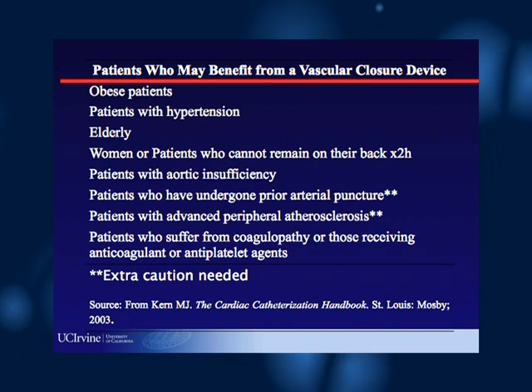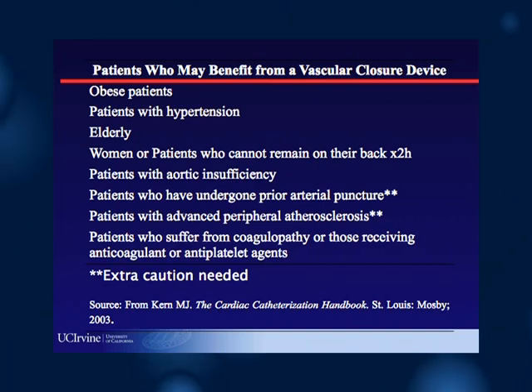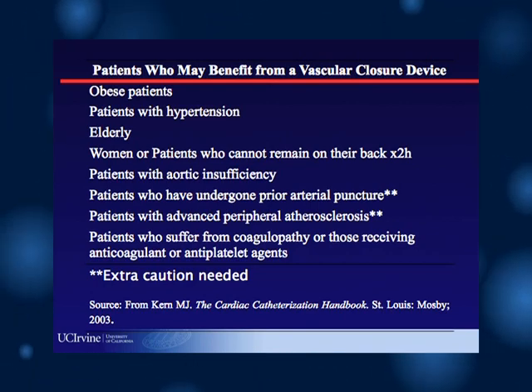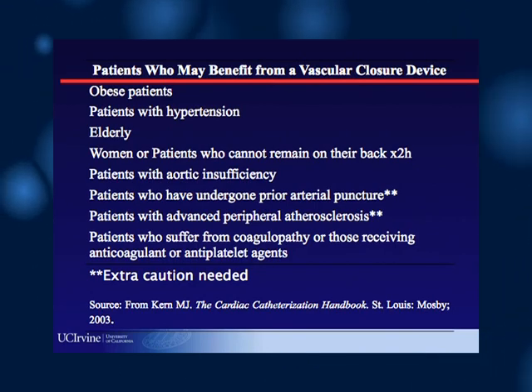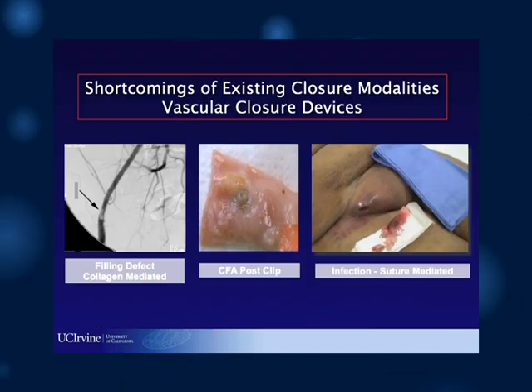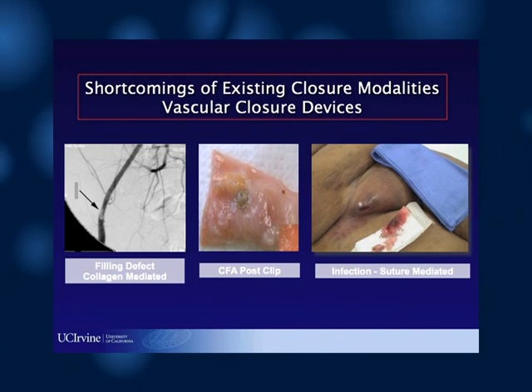Other patients who have coagulopathy and those on anticoagulants or antiplatelet agents require the benefit of closure devices to reduce the likelihood of bleeding. Caution should be maintained, and in this same group of patients, radial artery access should be considered. The use of vascular access closure devices, while highly successful, is often associated, on occasion, with complications related to the specific type of vascular closure device used.